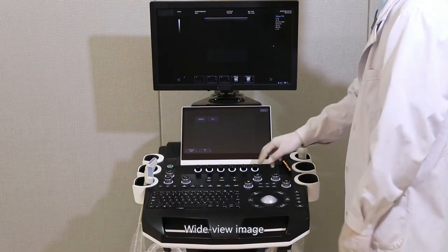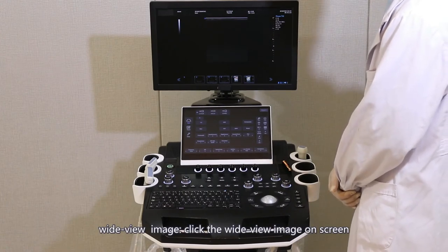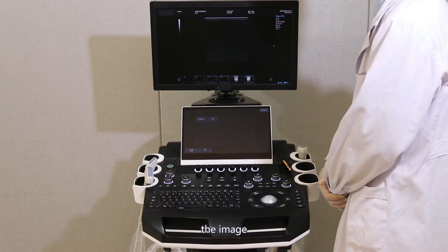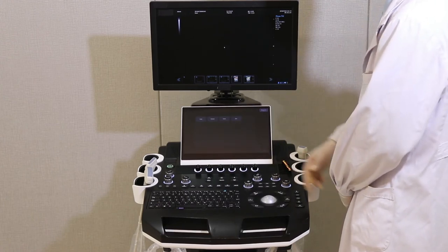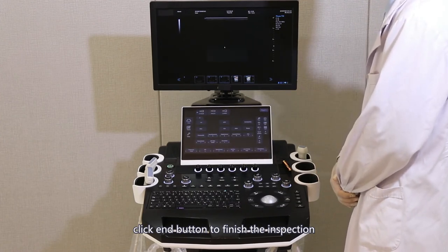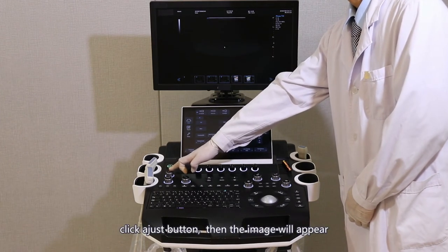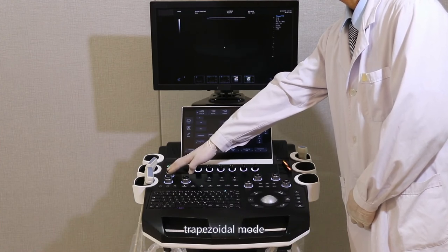Wide view image: click the wide view image on the touch screen to collect the image. After the operation is over, click the end button to finish the inspection. Trapezoidal image: under linear array prop, click the adjust button and the image will appear in trapezoidal mode.